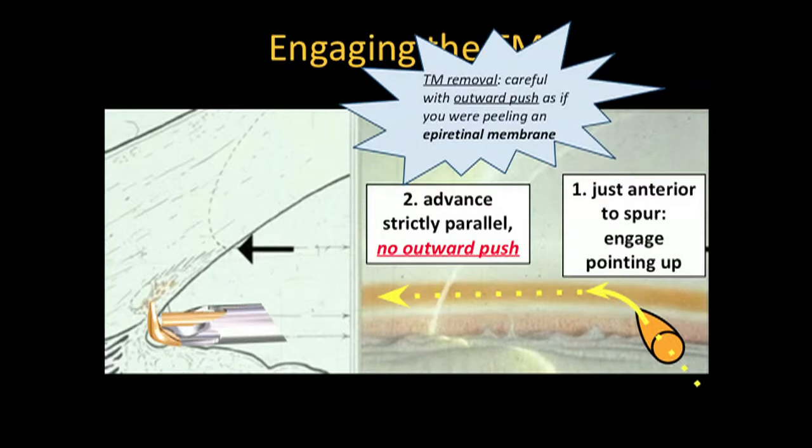Treat it like an epiretinal membrane really. Think of it not like a trabeculectomist who wants to punch 500-micron holes, throws sutures in, pulls with 0.12 or 0.3 forceps. This is a very delicate tissue. Treat it like an epiretinal membrane — think of what's behind it. Proper engagement looks like a zen moment, up and into the left. If you've done hundreds you don't even think about it. Here's a non-pigmented case — up and into the left without much resistance. You don't want to see the eye rotate when you advance it; if you do, you are stuck in the outer wall, maybe in a collector orifice.